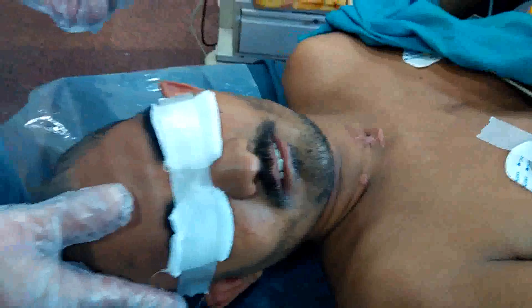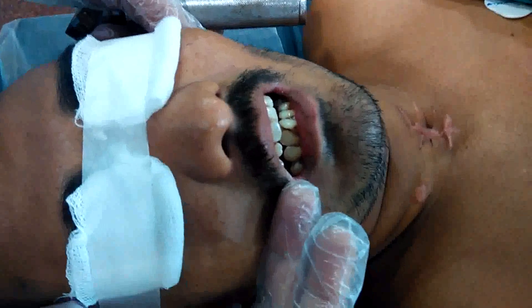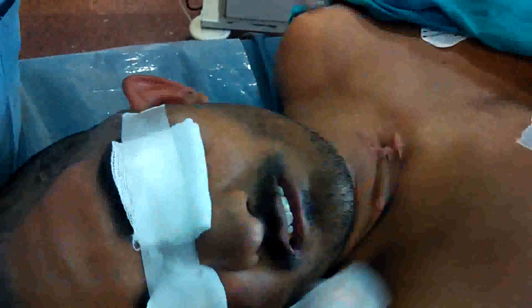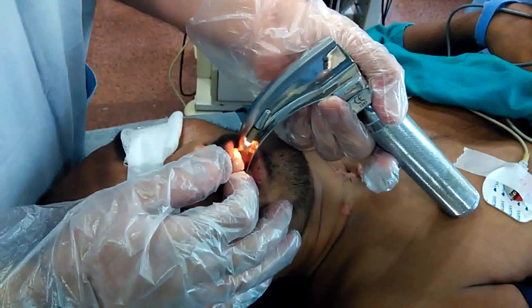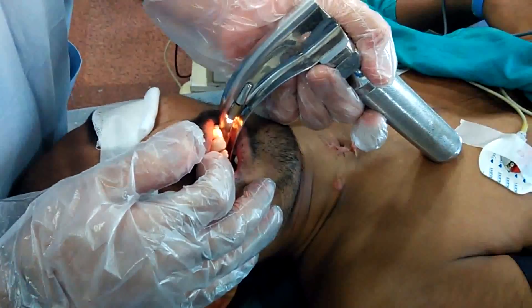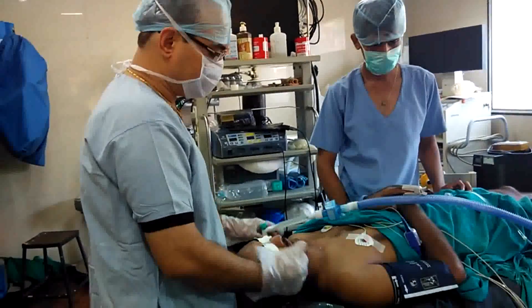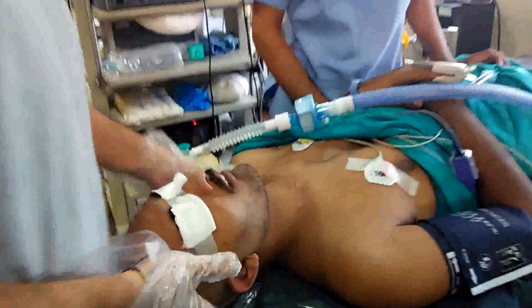We have a patient for cranioplasty. He has a receding jaw with limited, restricted mouth opening — it is not even possible to enter more than the tip of the Macintosh blade inside his mouth. This is our intubation patient with receding jaw, one and a half finger mouth opening, operated neck ostomy, posted for cranioplasty.